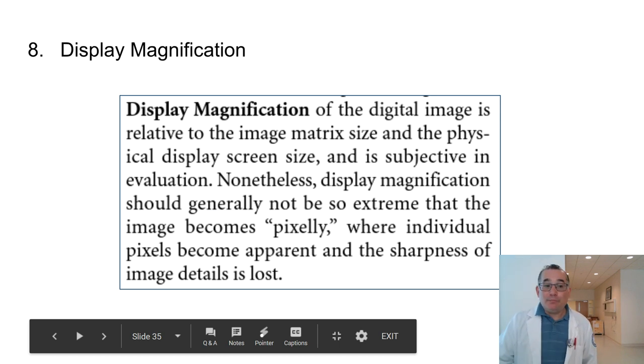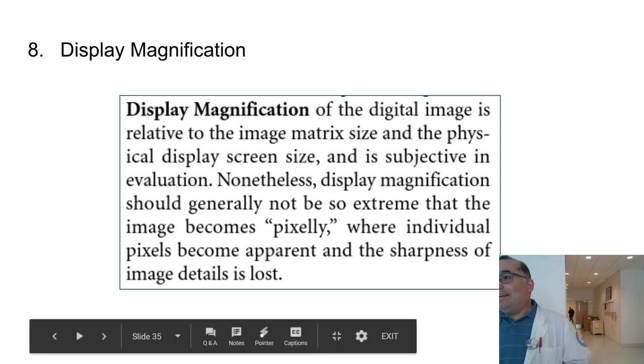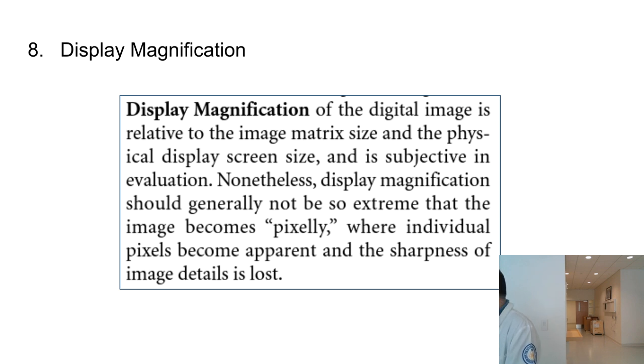Display. These should pretty much be set for you. You really shouldn't mess with the monitors. Occasionally, I don't know how often, all of the equipment, the plate reader and the monitor, go through some QC tests. Fairly often, though, people come in and vacuum inside and clean things and do what's known as PM. Have you heard that term, PM? Preventative maintenance. You do PM on your cars, before the red lights go on, so that they don't go on.